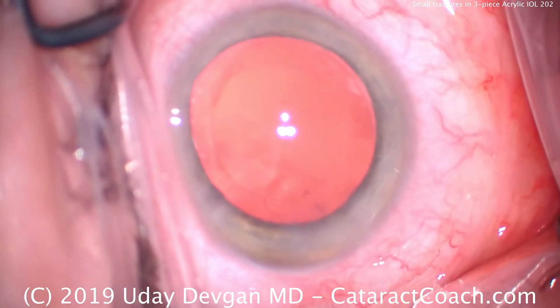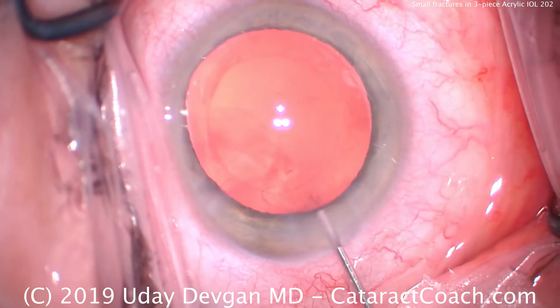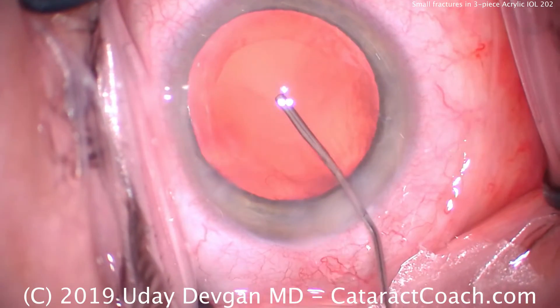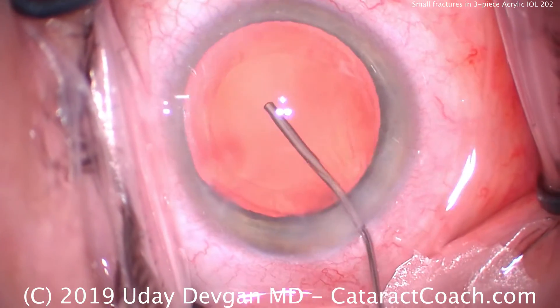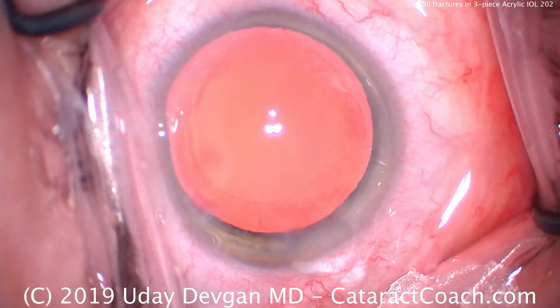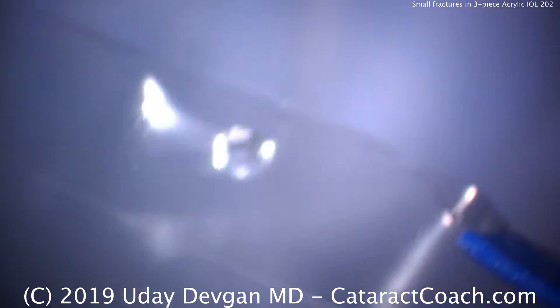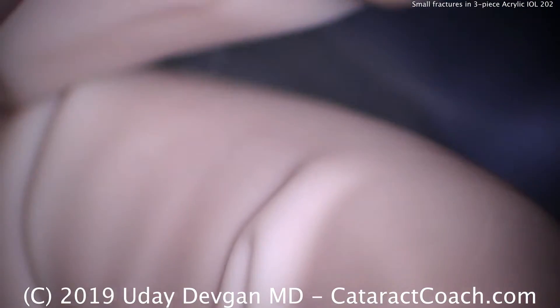It's cataractcoach.com. We've got a case here where the cataract's already moved. We're filling the capsular bag with cohesive viscoelastic, and now we're going to load our lens. We're loading up a monofocal lens, a three-piece acrylic lens, and we're going to follow the manufacturer's instructions exactly.